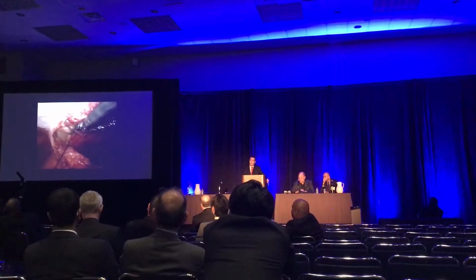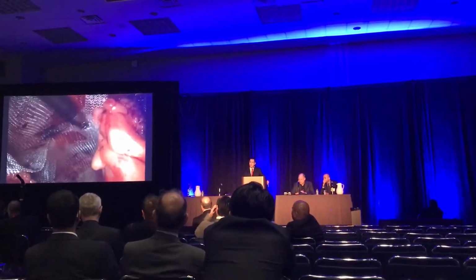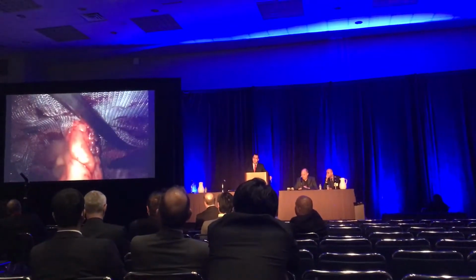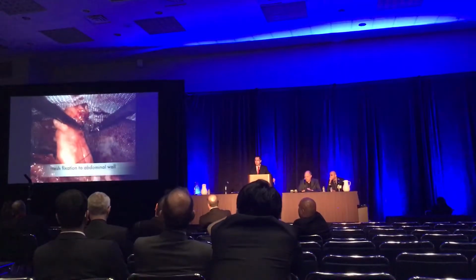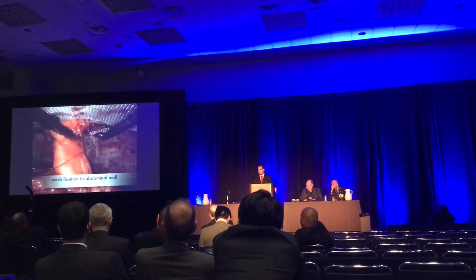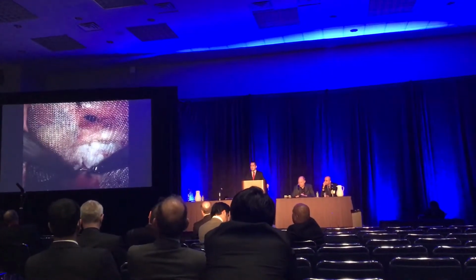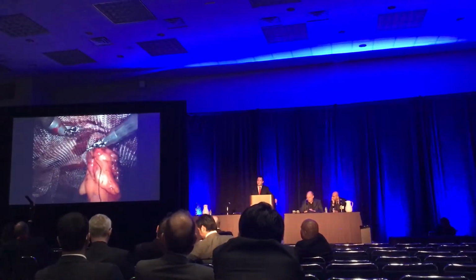Once the defects are closed, the 8mm piggyback trocar is pulled out to introduce a 20 by 20 lightweight polypropylene mesh, which is then positioned against the abdominal wall. Three absorbable sutures are used to tack it in place just to make sure that the mesh stays flat and stays in place. It is important also to use several sutures around the ostomy to make sure that the repair is adequate in an effort to prevent central recurrences.